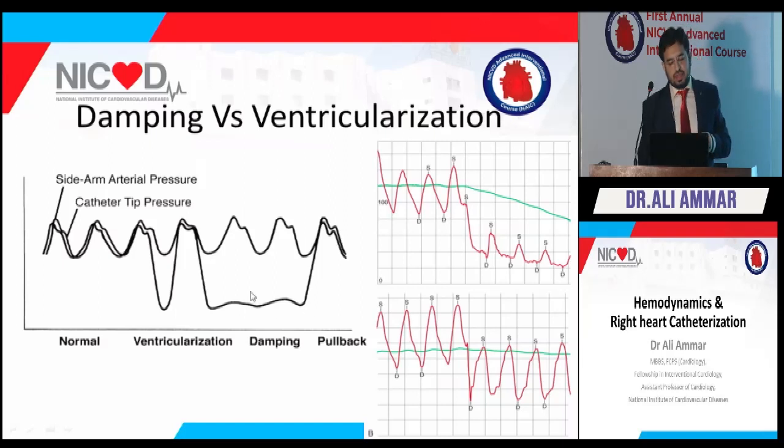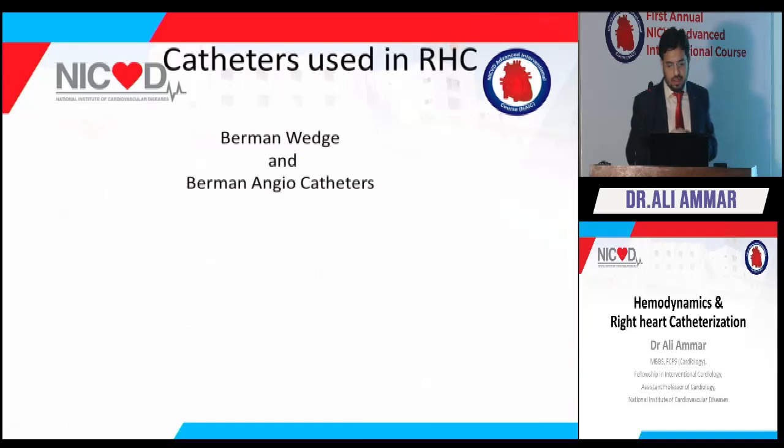So again, the catheter's pressures are damping, but the arterial pressures are not damping. This also happens whenever there is a coronary with a smaller diameter. So we should see where the problem is, in the catheter engagement or in the diameter of the coronary.